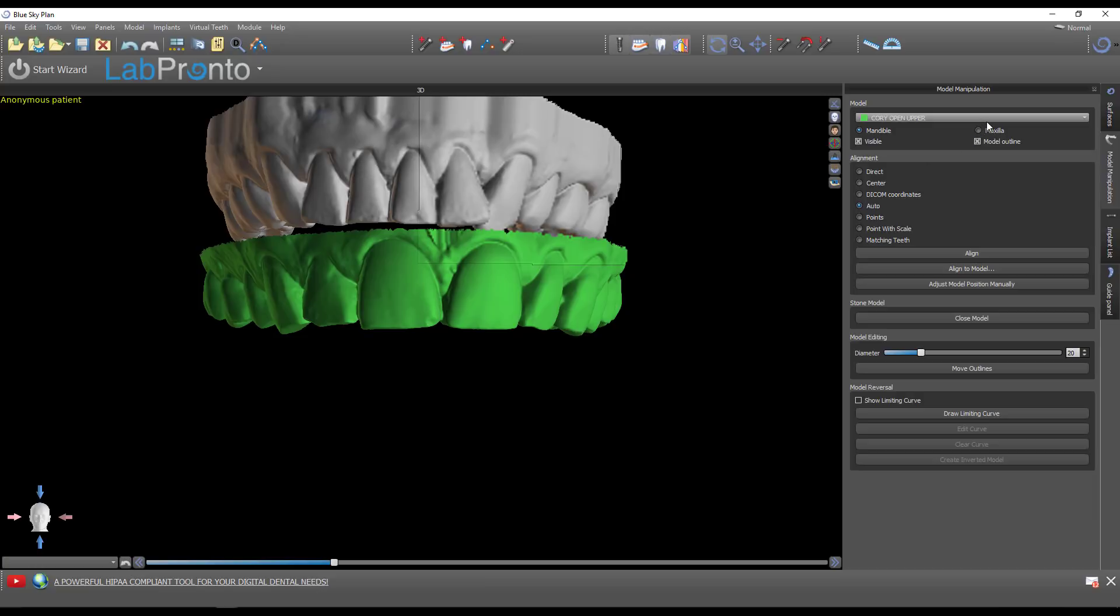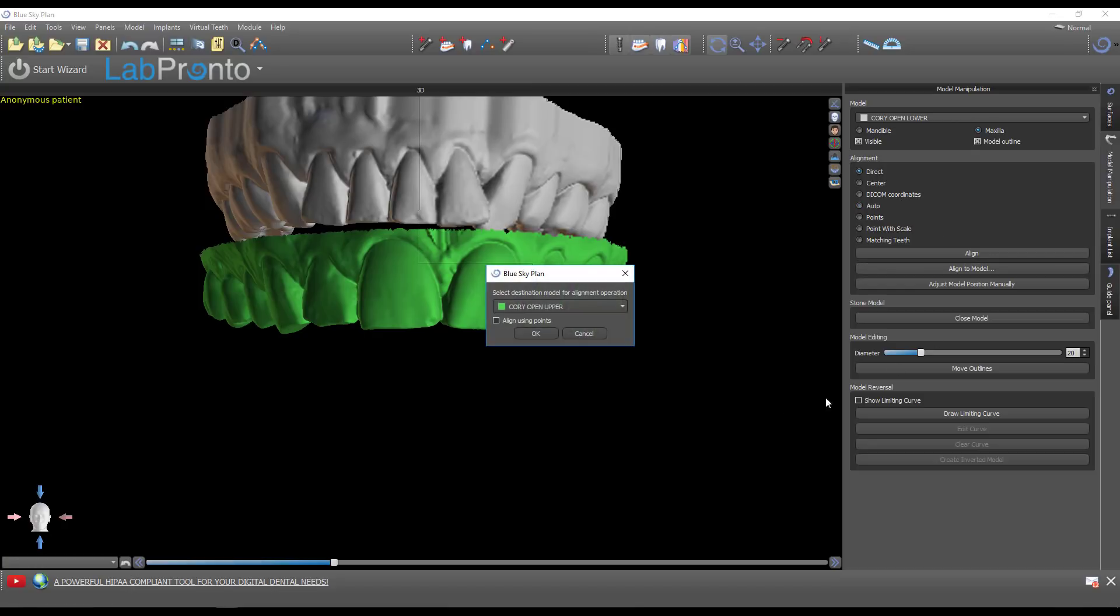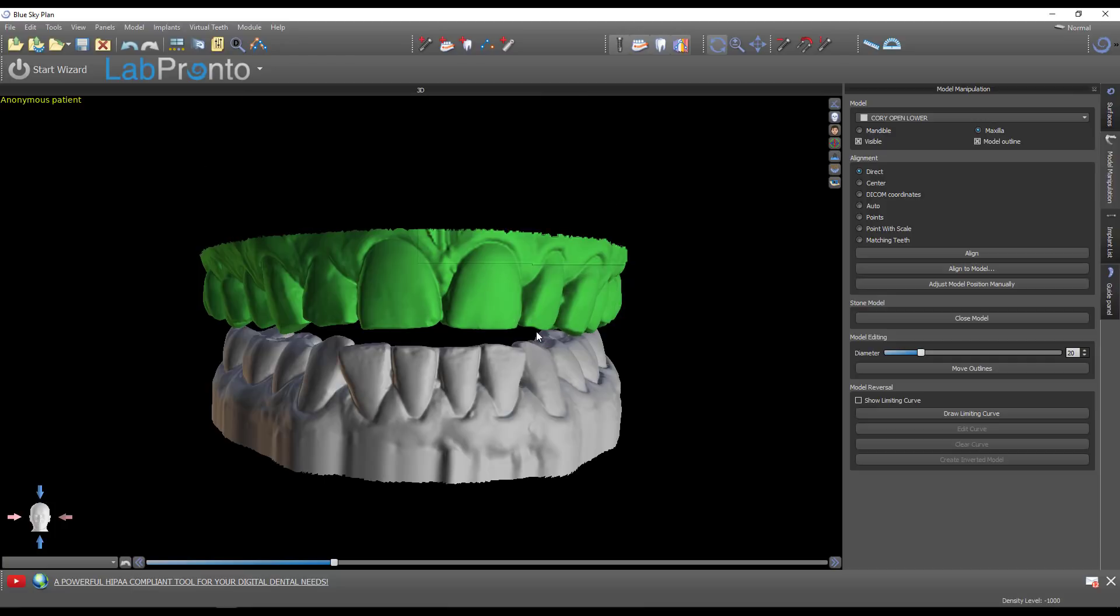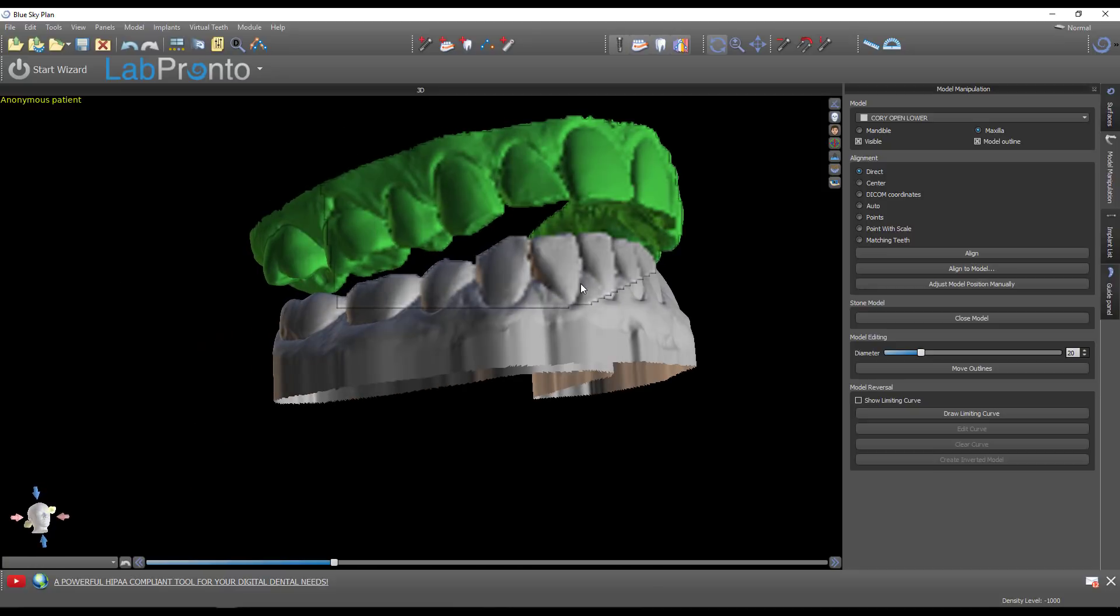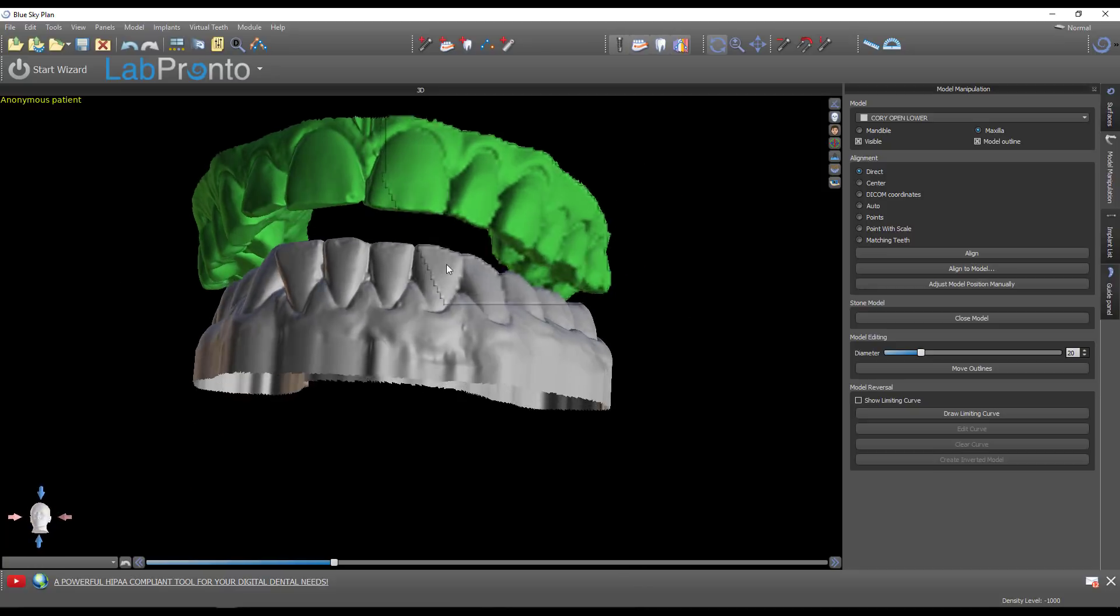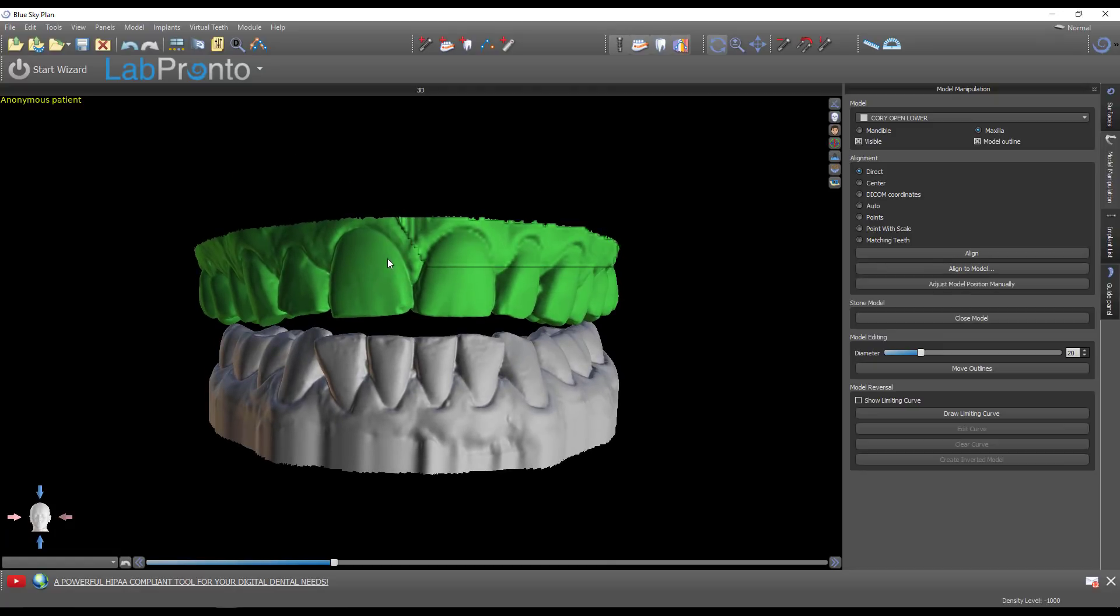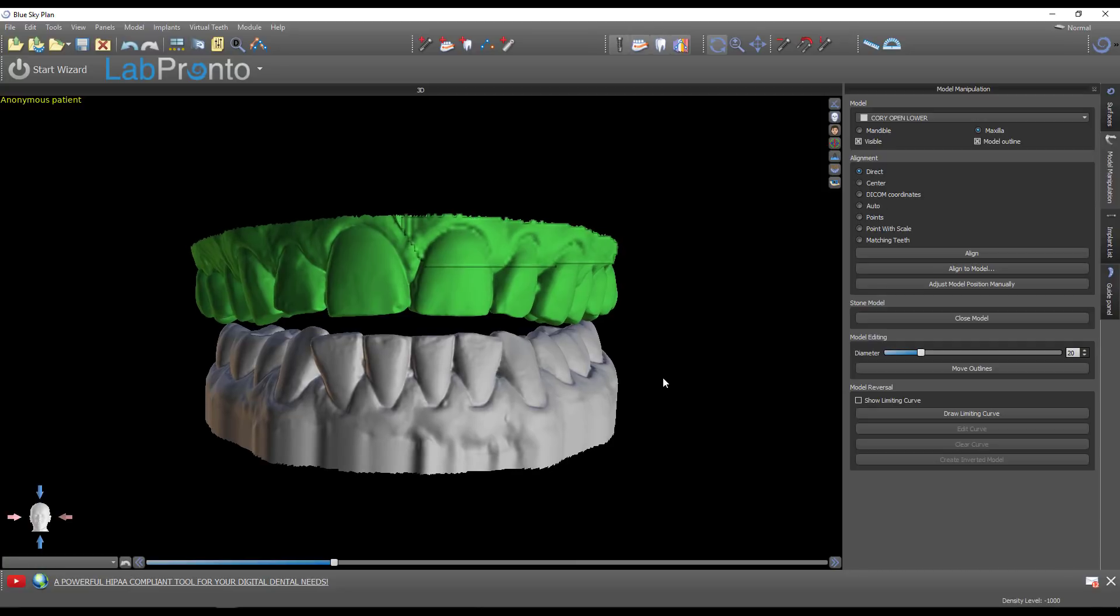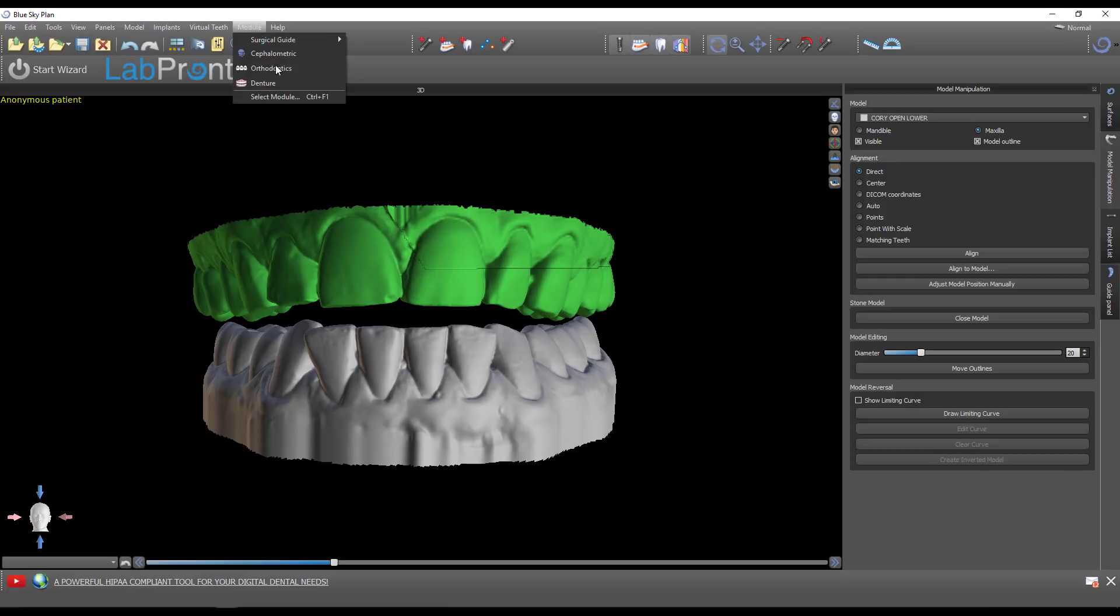Now we've lost orientation with the mandible. Select the lower model, choose direct alignment to model, and align it to the green one. STLs save their relative position to one another, so when these were in that original position, if I change one it pulls them back into their original relative position. Now my models are aligned to the skull. Let's switch to the denture module.